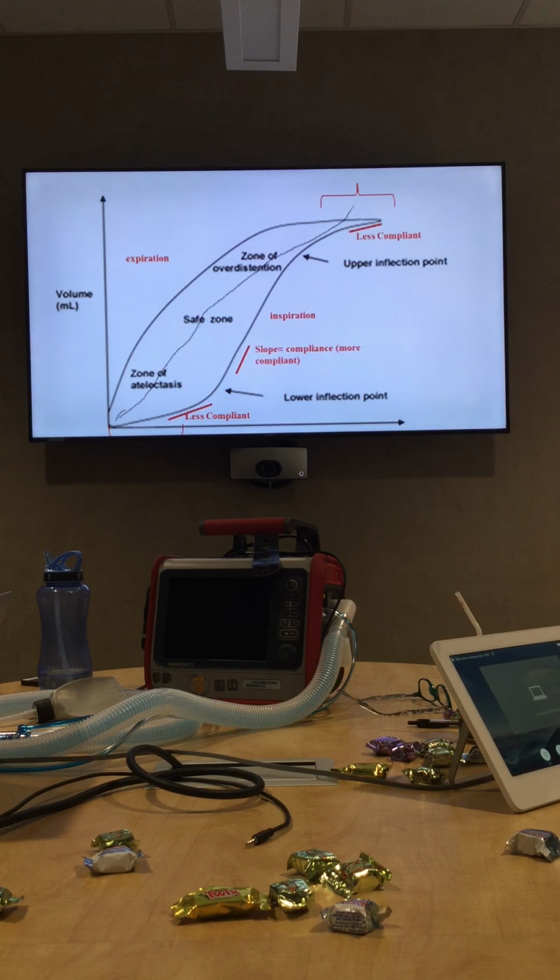When we start looking at how bad a patient's lung volume or compliance is, I'm going to start looking at their inflection points. I know you guys won't be able to see that on your monitor, but the concept is that when I look at that pressure waveform you talked about earlier, and you see a pressure overshoot because I've given too much pressure, you'll be able to see what you're doing.